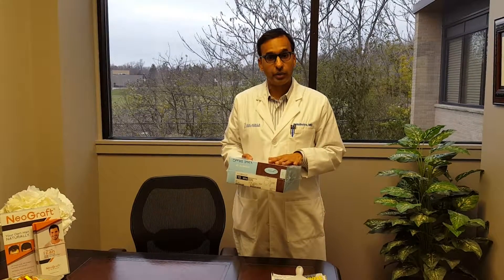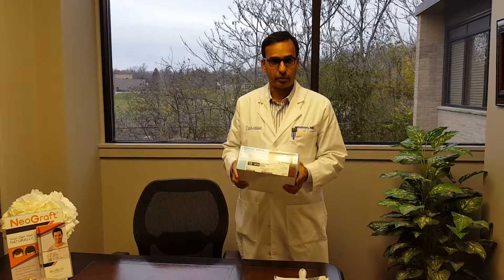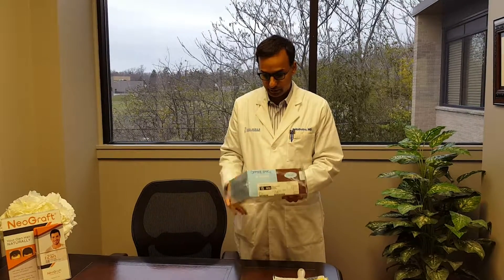This is how a silicone implant comes. A lot of patients don't get to see this part of it. The first question is why we're opening up a sterile implant — that's because this one is expired and can't be used, so we're using it as an opportunity to show you how this comes packaged.